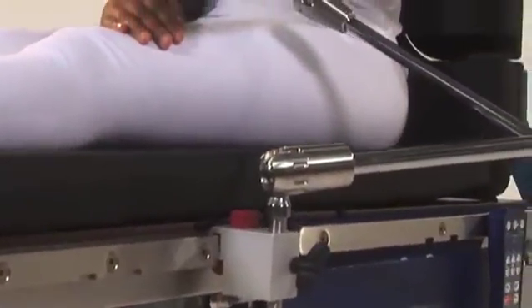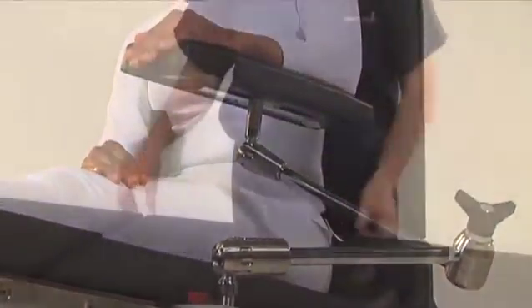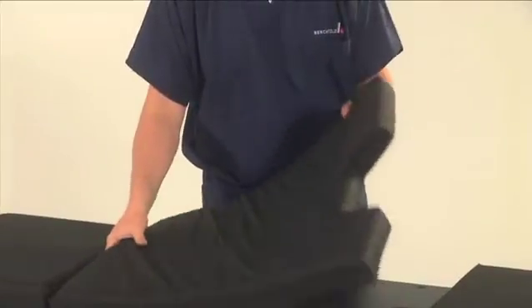The side rails are US standard to ensure your facility's existing accessories will fit the D820. Table pads are attached by a velcro strip down the center of the pad.